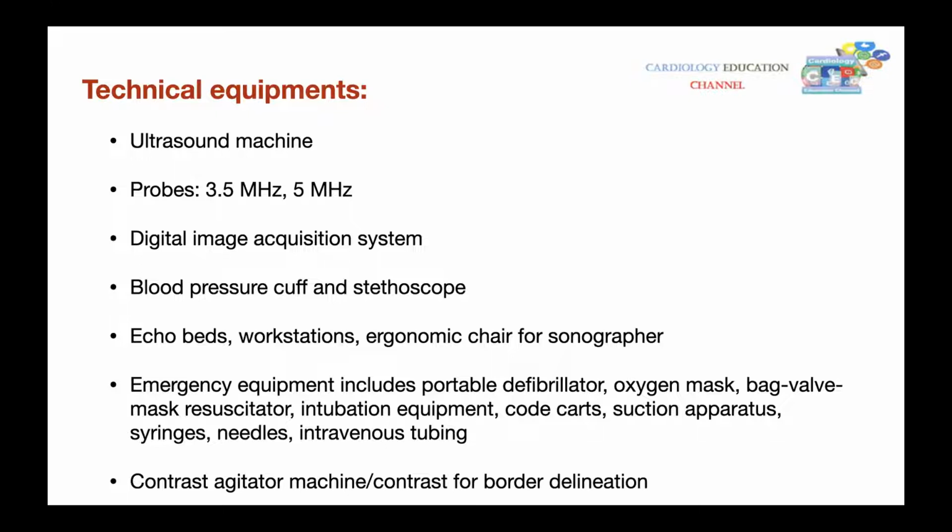You may also need a contrast agitator machine if you are going to use contrast to see the myocardial borders, as my friend Dr. Alexander will say in his lecture.